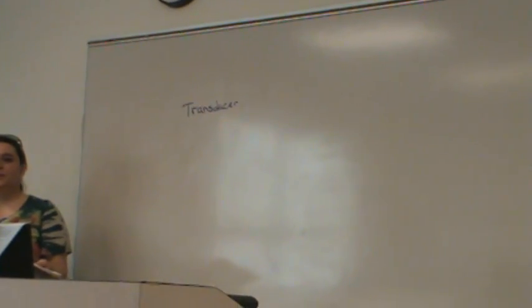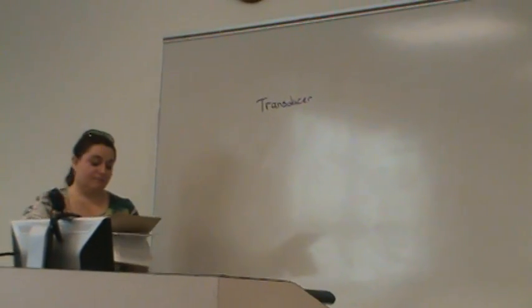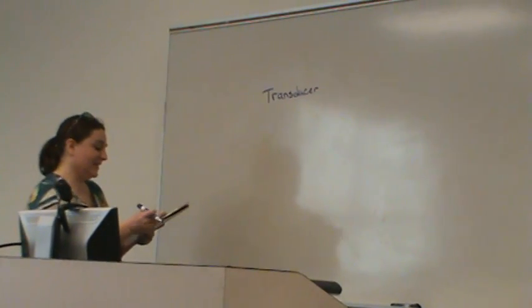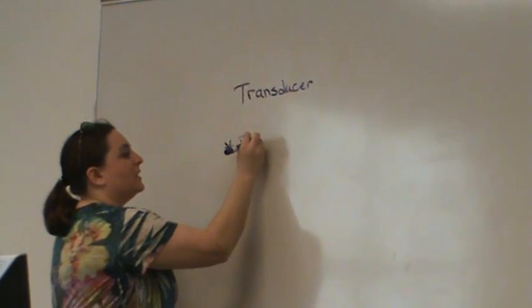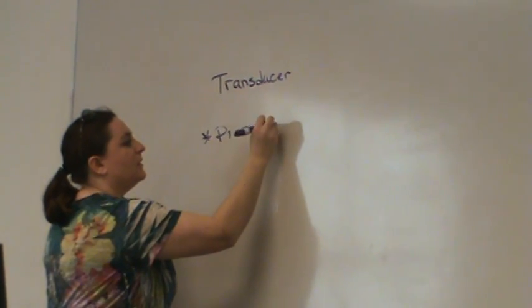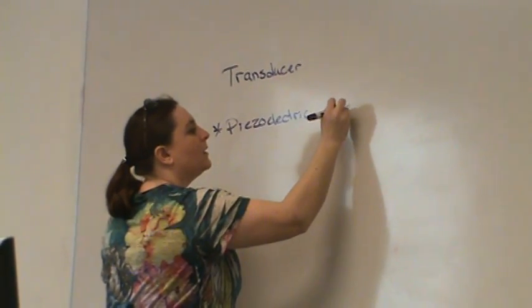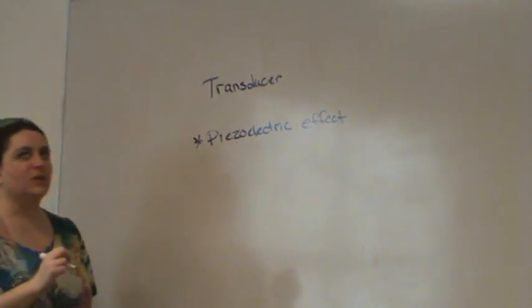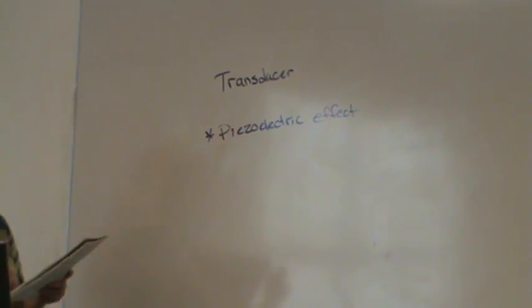I don't know why people do poorly with transducer stuff, but they do. So we'll just keep going. Remember, our transducers use that thing called the piezoelectric effect. This is where we change an electrical voltage into an acoustic pressure wave and vice versa.